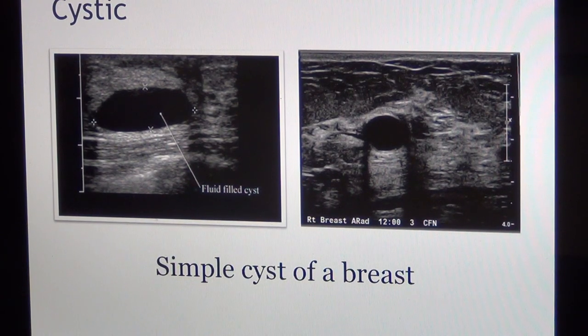As a result, the beam's brightness on the other side is more, but this is the area where the beam's intensity was supposed to come this way, but it did not. It moves in other directions. So this is darker because the beam's intensity is low here. Okay, so that's why it is called edge refracting shadowing.